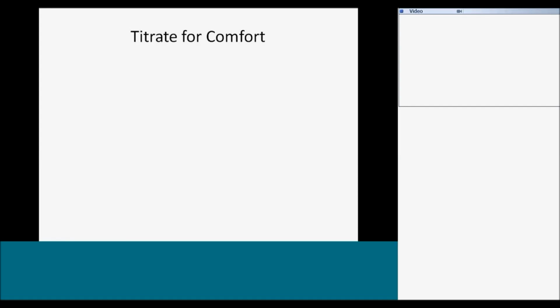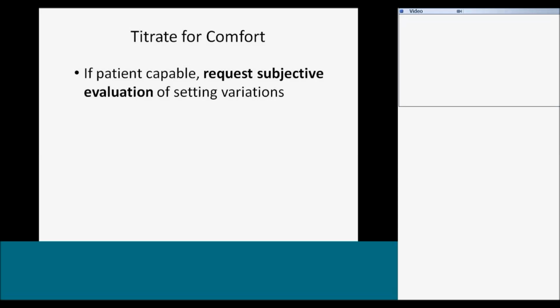One of our other goals that we're titrating for, besides normal end-tidal CO2 and normal tidal volume and minute volume, is comfort. And this is very important. So as you make adjustments to the settings, request subjective evaluation from the patient. And I compare it to an eye exam. You may just try a setting on the patient and say, how does this feel? Let me alter the IE ratio a little bit. How does that feel? And then go back and forth. Oftentimes, IE ratio is set as a factor of patient comfort for long-term use. So you might just try a little bit more of this, a little bit more of that.